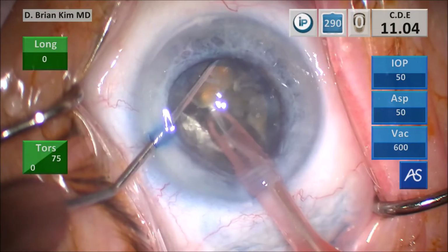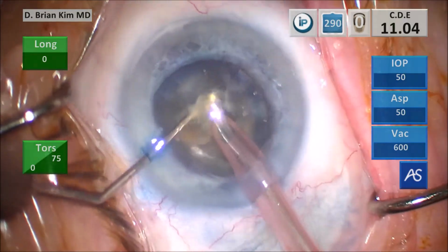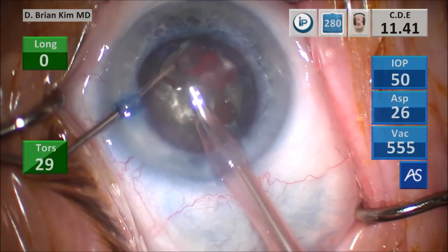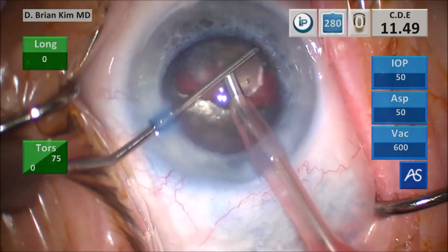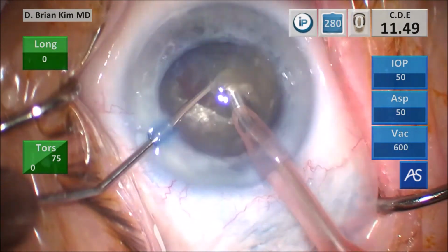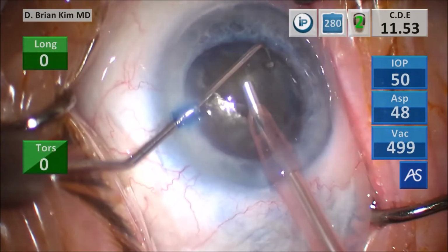Placing the chopper again around that fragment, pulling it up, and then fracturing it completely as well. That's the benefit of placing the chopper around the lens. Not only can you get a through and through chop and you're holding the lens from the other side, you're not causing any zonular stress, but also you're able to lift it out of the bag, which makes access much easier. Placing the chopper around that fragment once again, fracturing it against the phaco tip.